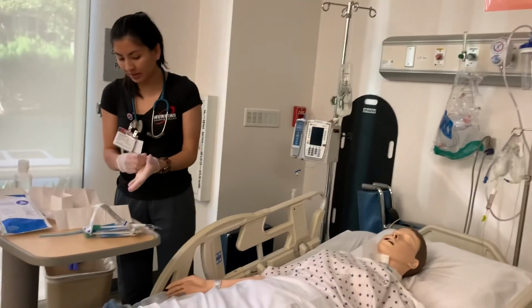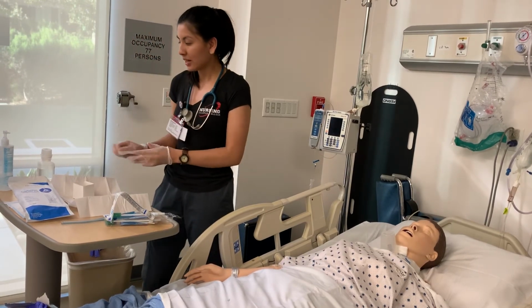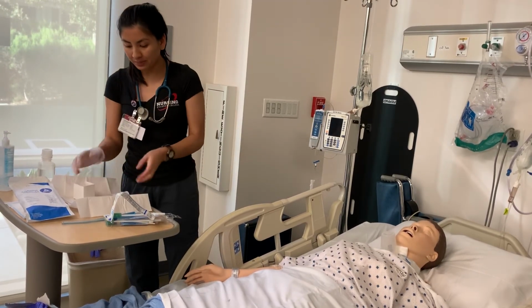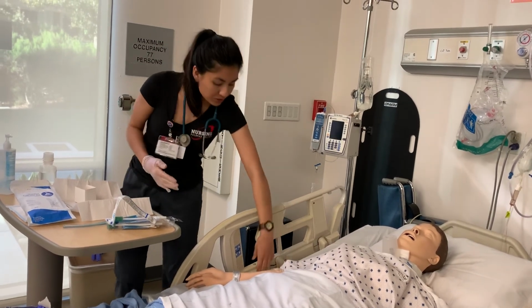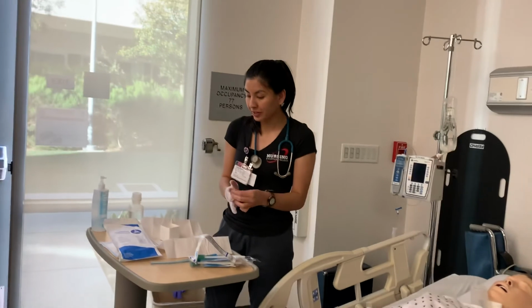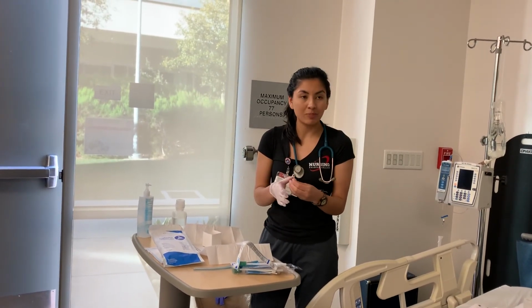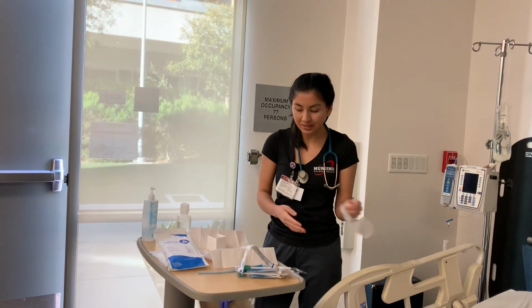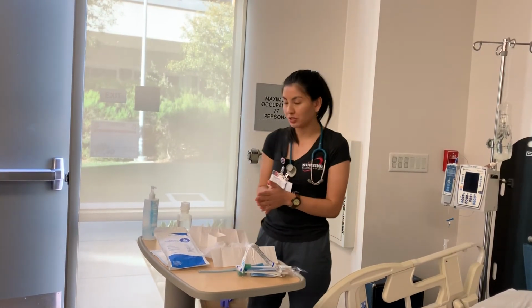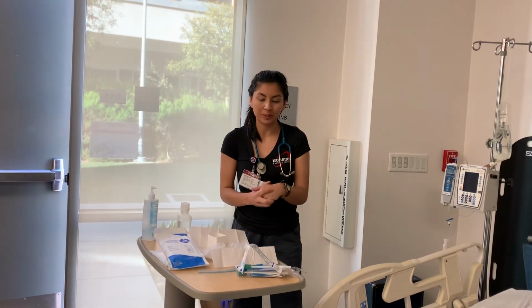So I'm just going to leave that there, and then I would throw away all my trash and perform hand hygiene, and then I would go to document for my patient. For documentation, I would be documenting the color, consistency, amount, and any odor, if there was any, for the sputum that I collected. And I would also document how she tolerated the procedure, if she had any pain, or if she tolerated the procedure well. And that's it.